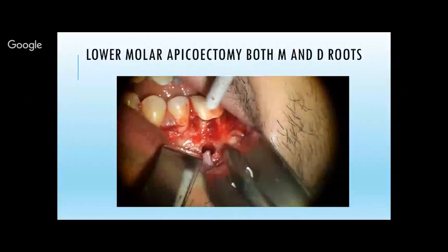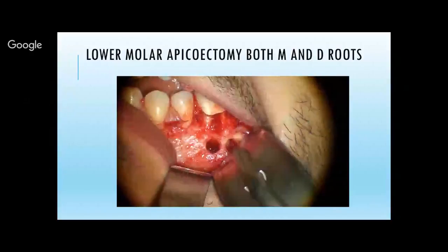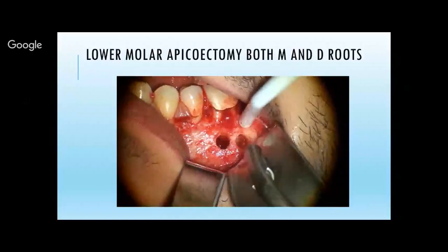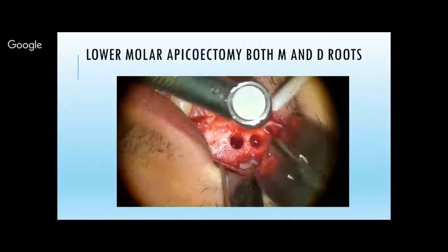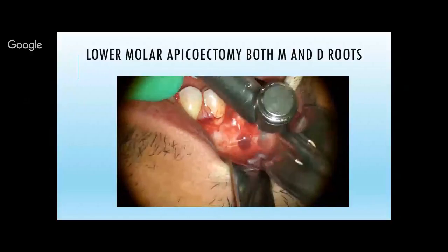So those are the surgical crypts after using the direct cut drills. You can see the mesial root is completely resected. The distal root, you can see the surface there. I just barely gouged it. So after that, I have to go in and perform my apicoectomy on the distal root.